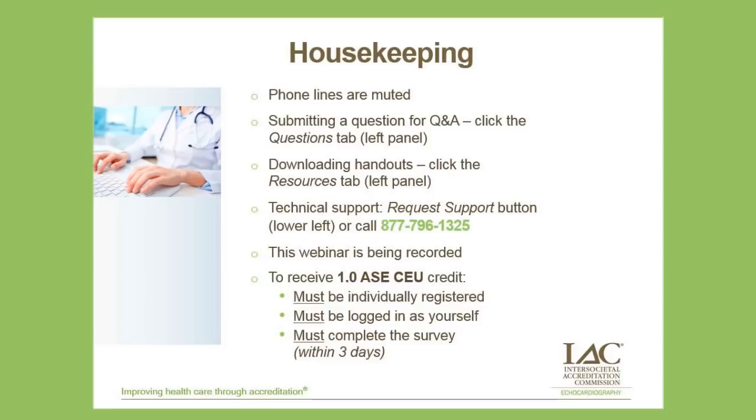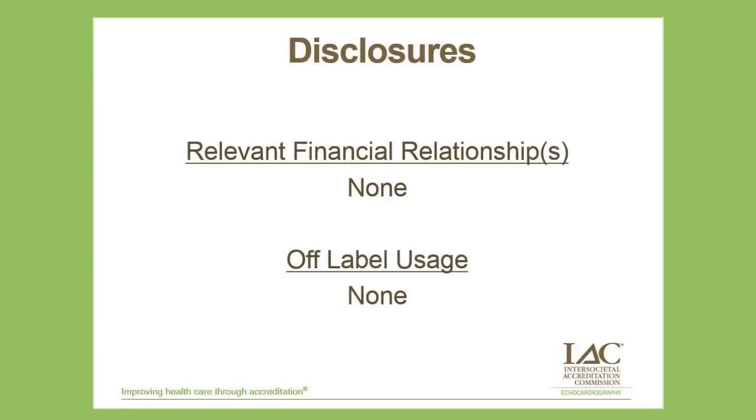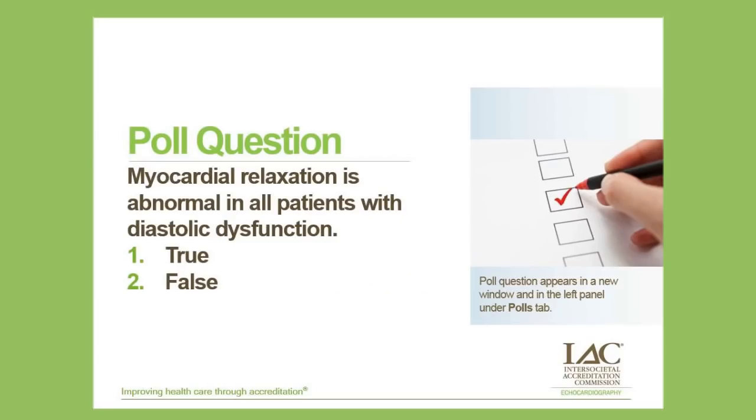Mary? Thank you so much, Kelly, and welcome, everyone. I'm hoping that the next hour or so will be very helpful to you. First of all, I have no disclosures, and we do have a couple of poll questions, however, that I would like to start with. My intent is to ask these questions now, and then we'll ask them again at the end of the presentation so we can see how much you learned during this hour.